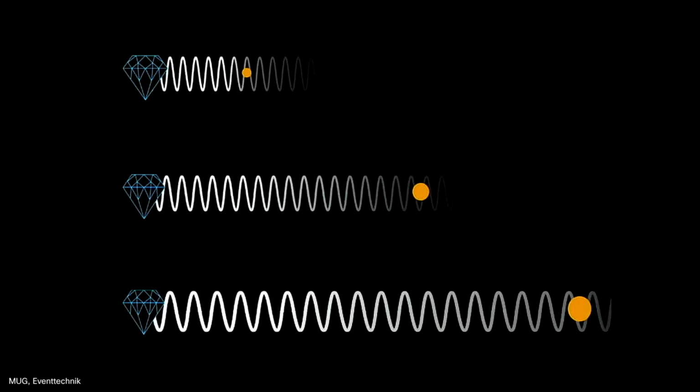Correct. And you do that because a lower frequency allows us not only to penetrate the walls of a building, but also to penetrate deeper inside of the body. And we can have a deeper look inside. But there are also probes which are using a high frequency. And actually, why should we use them? Because, as you can see, we cannot look that deep with them. Well, a high frequency means we have a short wavelength, and a short wavelength means we can see smaller structures. And this is why we get a better resolution, compromising the penetration depth.